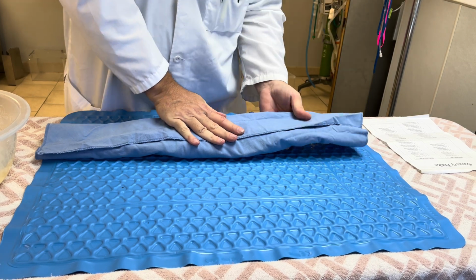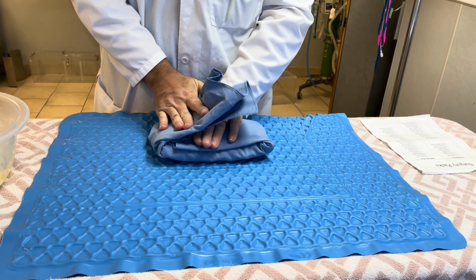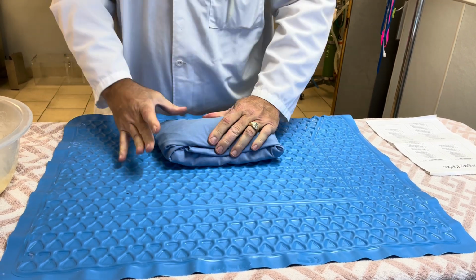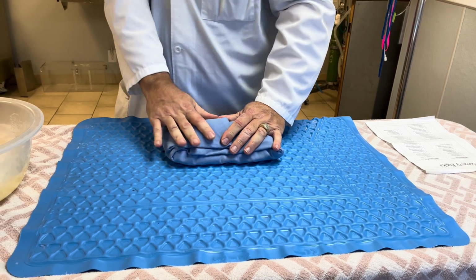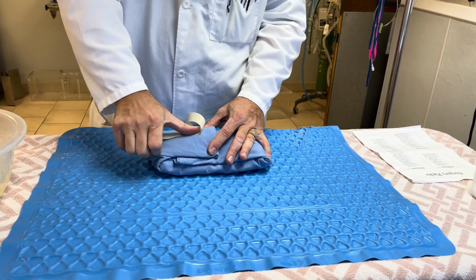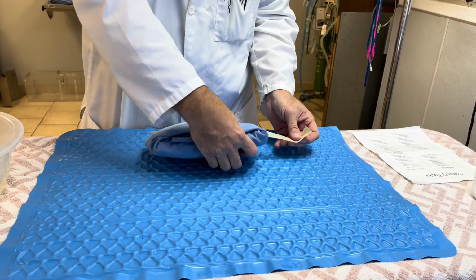There we go. And then you pull one side. Now the bottom side can just fold over if your pack's big enough, no problem. This side, you want to fold under like that. Okay, and then, I don't have the tape here, but. Right there on the side. Oh, okay, great. Then you use a piece of masking tape and see how we have the little tab so you can pull it off?